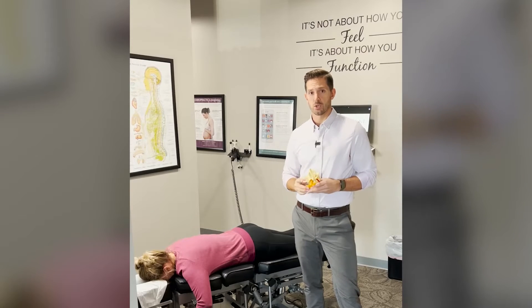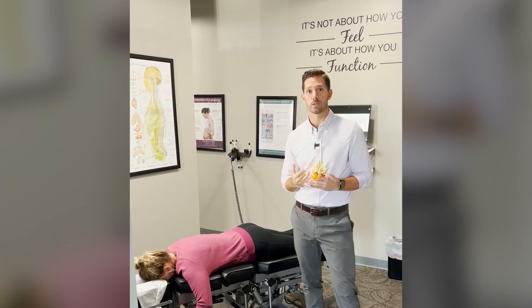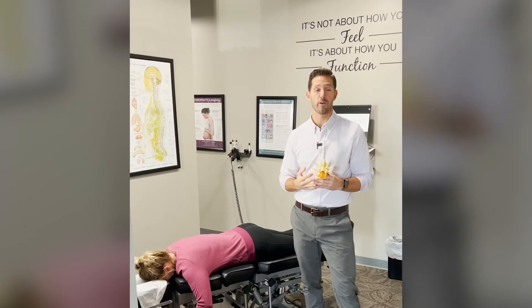What I'm going to show you today is our flexion distraction table. It's a really great table for people with lower back conditions — anything from disc bulges, herniations, or degenerative arthritis.